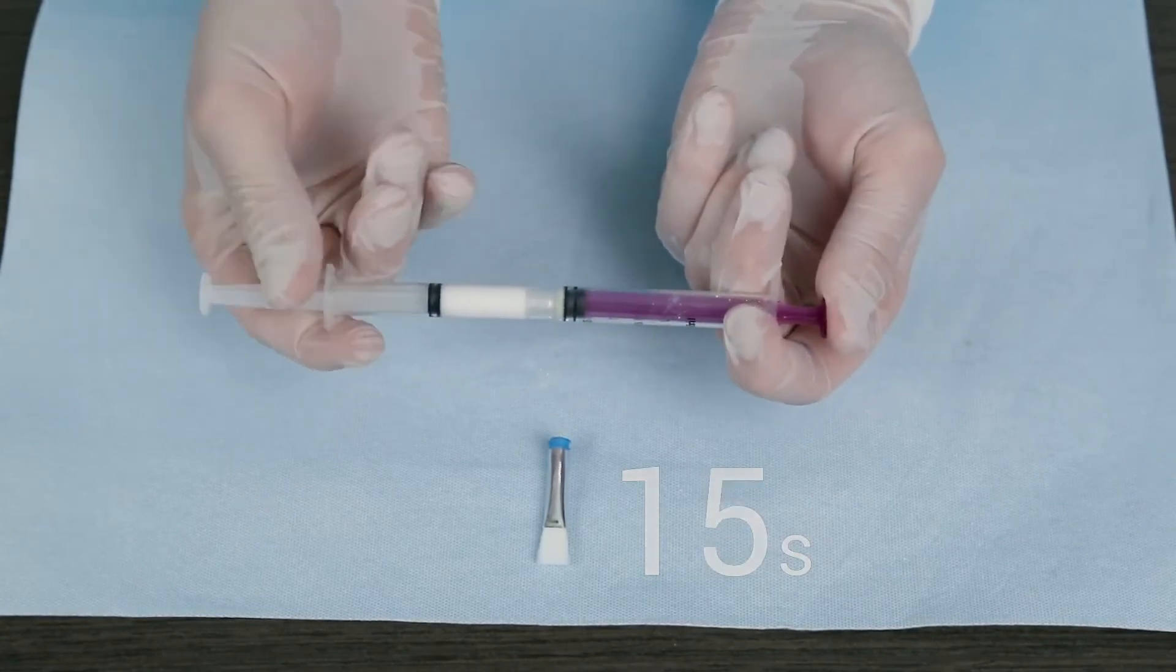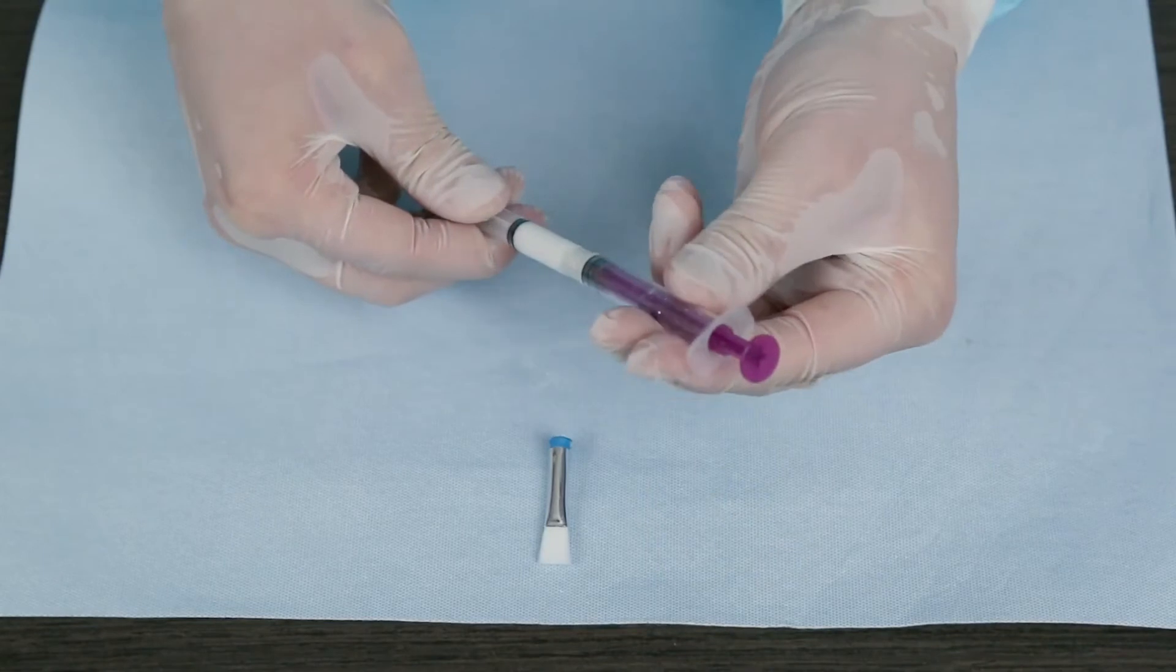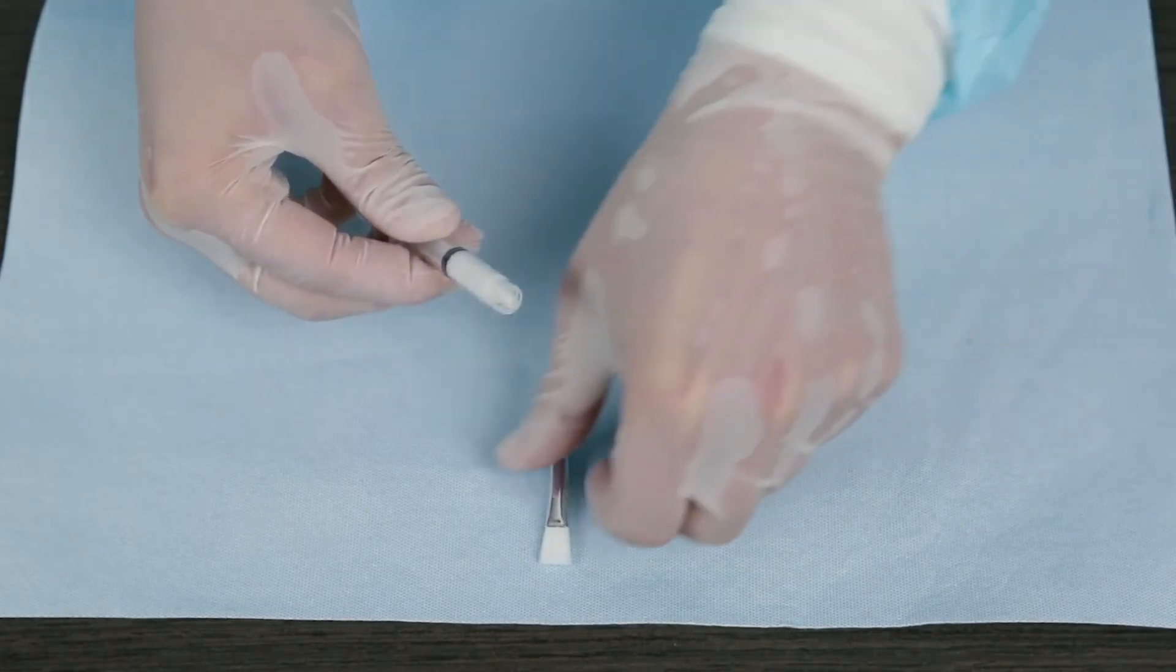Once mixed, push all the liquid into the larger male syringe. Disconnect the two syringes and attach the sterile application brush tip.